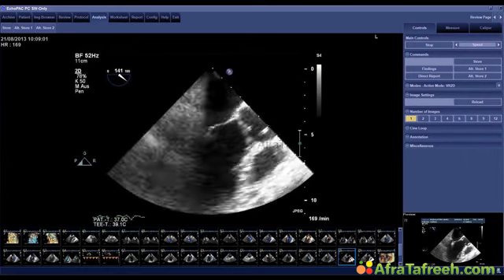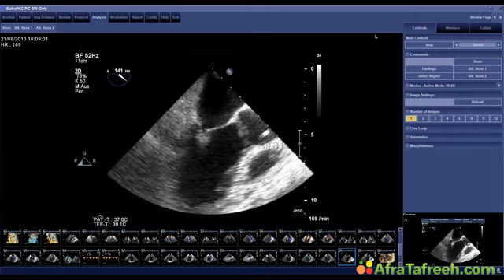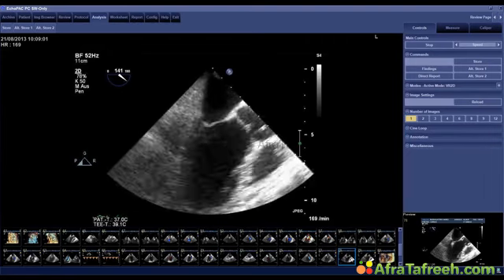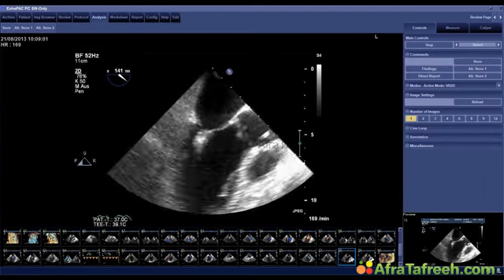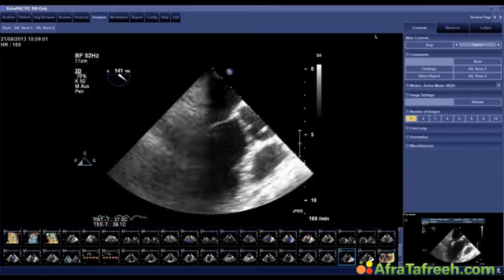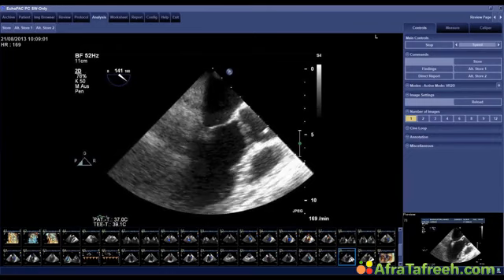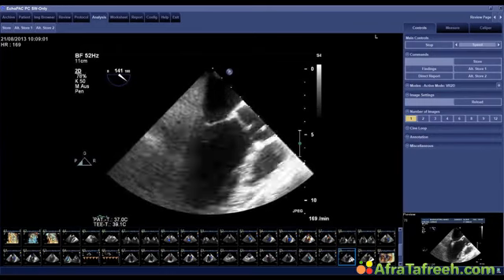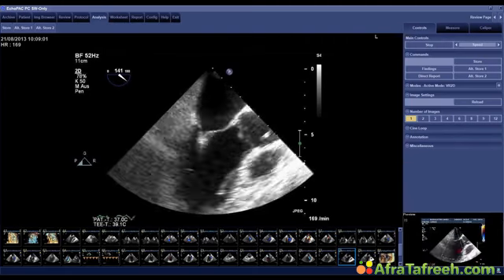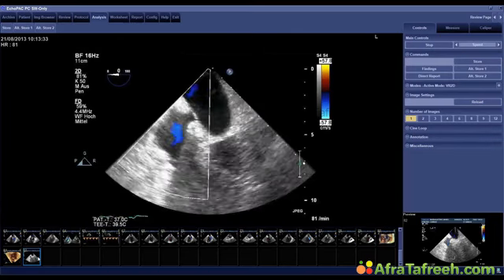Isabella asked, can this mitral clip dislodge and cause embolism? The answer is yes. This is something you really try to avoid, and this is the big fear that everyone has. There's several things that can happen. First of all, you can only have partial detachment, which means it's only hanging on one leaflet. And the other thing, it can really dislodge. But I think there's only 2 or 3 cases in the world where that really has happened. It's something that, fortunately, is fairly rare, if you use echo to monitor the moment of really grasping the cusp and when you are sure that you're really there where you are.